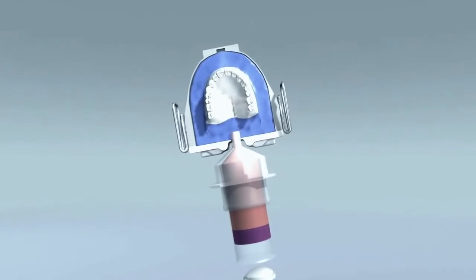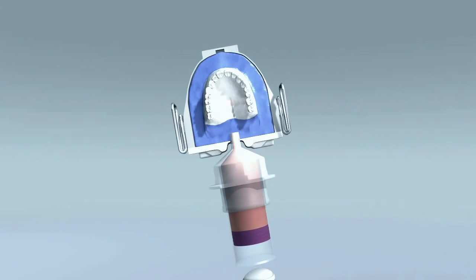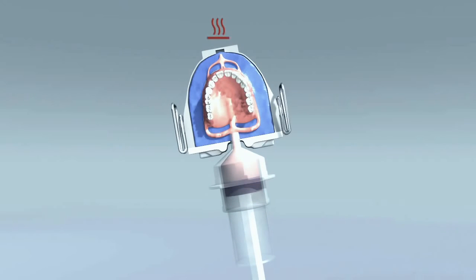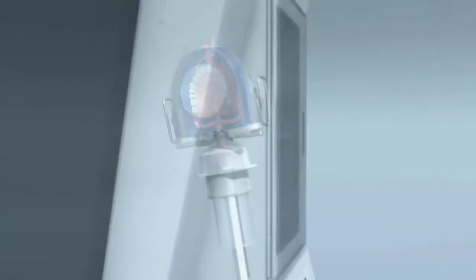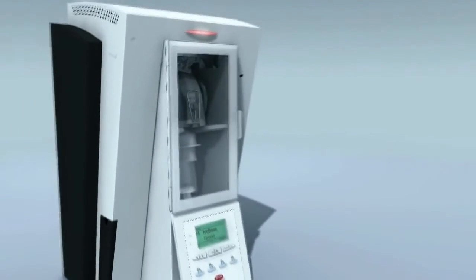With IvoBase, the air in the anterior region automatically and completely escapes through the aeration filter until the flow of the resin seals the aeration filter and sets. This is necessary because displacement of the air through the stone is not always possible when using auto-curing polymers in the injection technique. The hollow space is thus aerated in a controlled manner, which also prevents bubbles and porosities from forming in the resin.